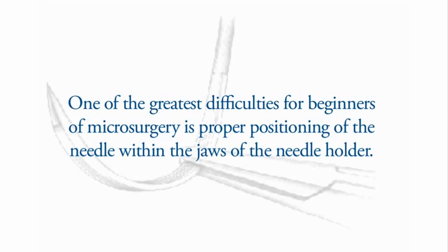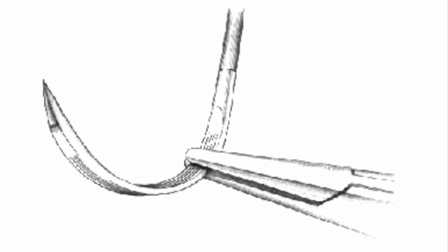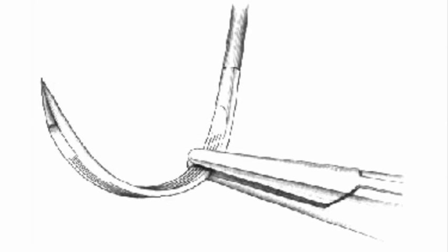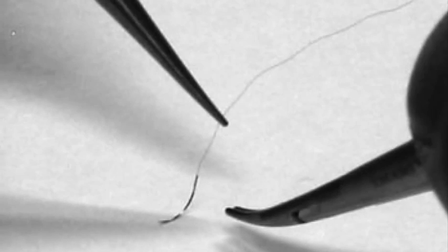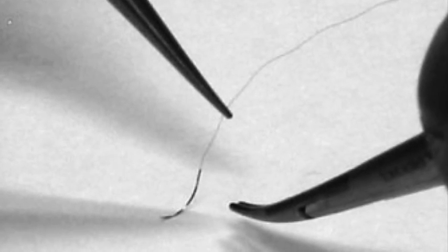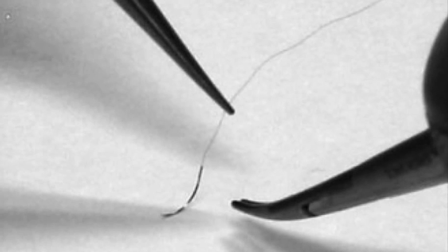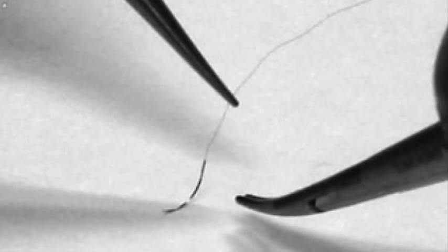One of the greatest difficulties for beginners of microsurgery is proper positioning of the needle within the jaws of the needle holder. Fortunately, you will be using flat needles, whose flat shaft facilitates alignment of the needle within the needle holder. Lift the suture until the needle just touches the surface below. This will facilitate rotating and orienting the needle appropriately within the needle holder along the flat surface of the needle shaft.